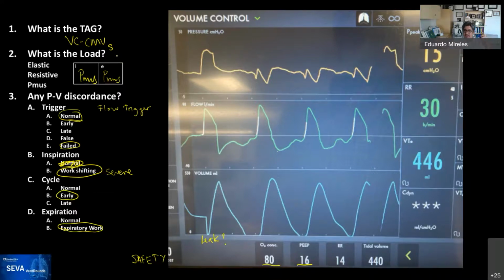Yeah, I can imagine. So Haura Halal says we're having similar waveforms during our crisis in Lebanon with the unavailability of paralytics, and under those circumstances, you have to say, well, what do we do? I mean, if this patient is working against the ventilator, he's trying to trigger even more breaths than what he's getting. Really challenging. So let's take a look.